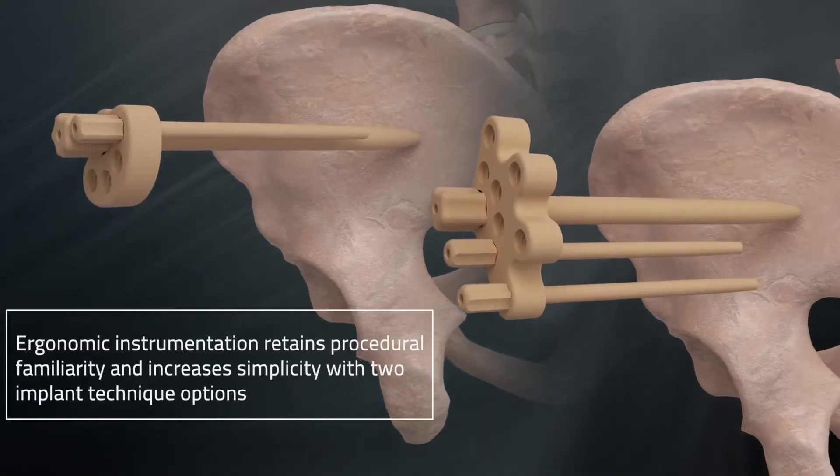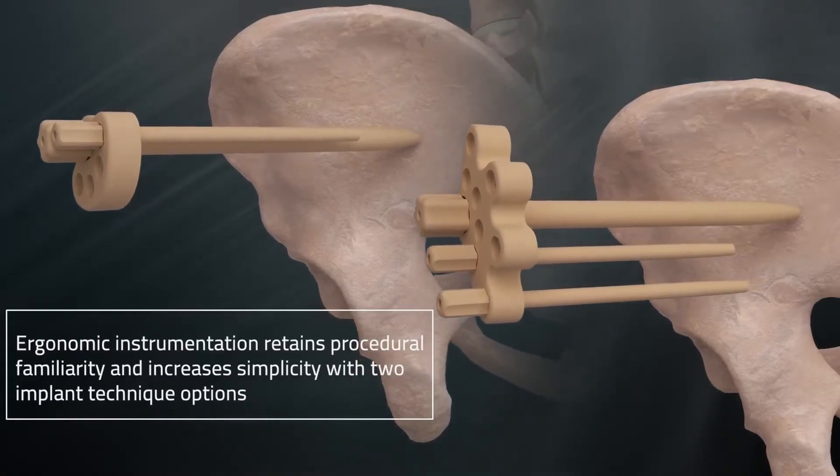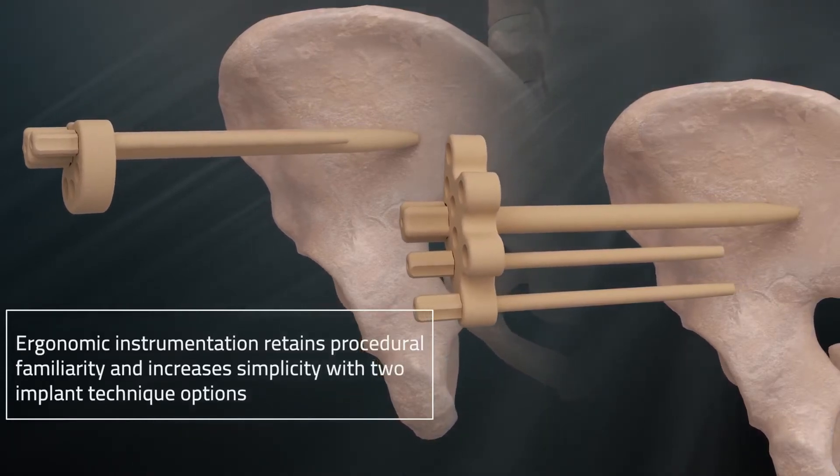Ergonomic instrumentation retains procedural familiarity and increases simplicity with two implant technique options.